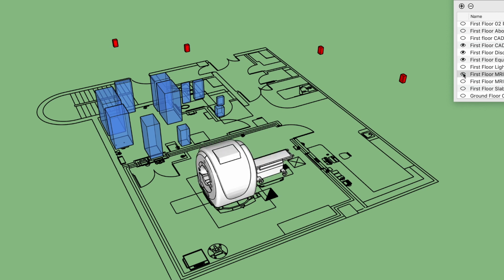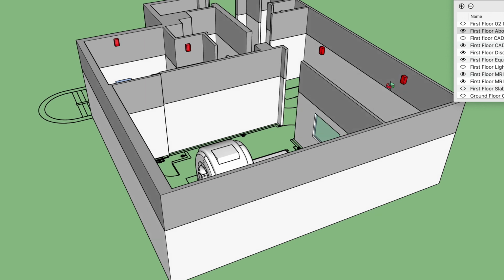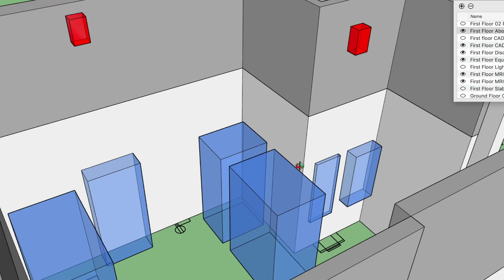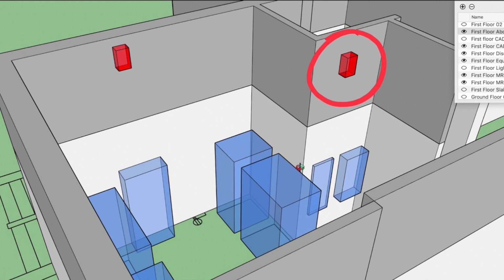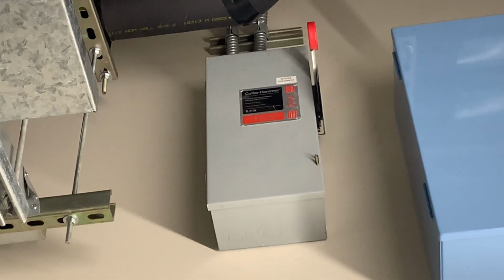This is your equipment room equipment, that is your MRI, and these are your walls, below ceiling and above. If we zoom in on one section of the area, we can see inside the equipment room there are 2 disconnects above the ceiling, located in the gray. If a maintenance or facility personnel were to come in, on their right, they would find the first disconnect. In the event that this disconnect is tripped, please locate an electrician on site or facility maintenance.